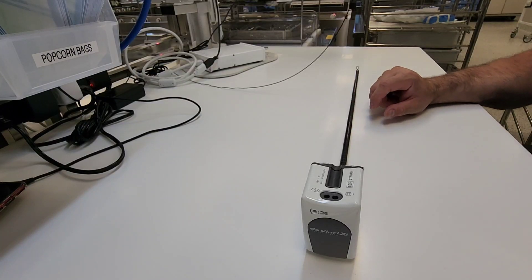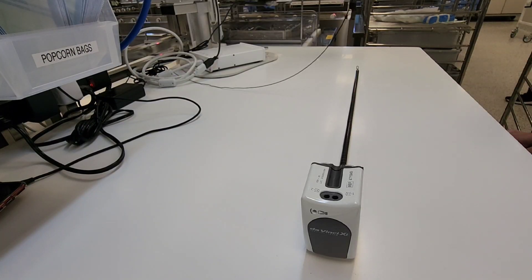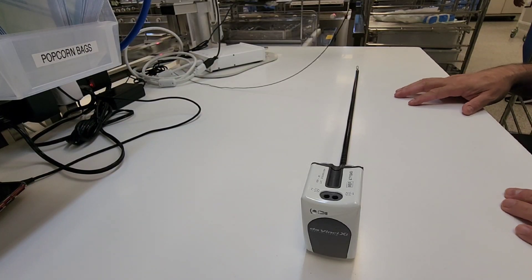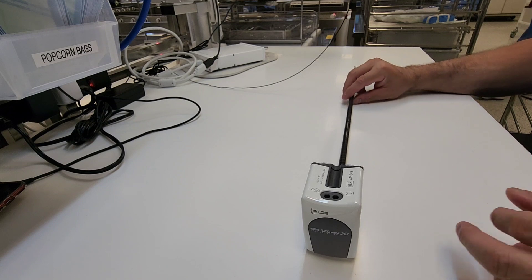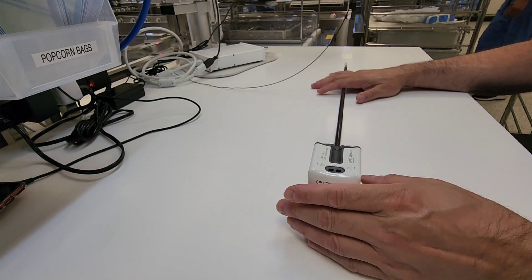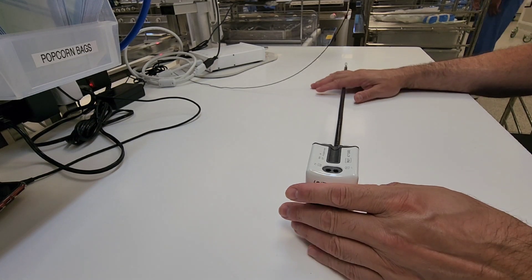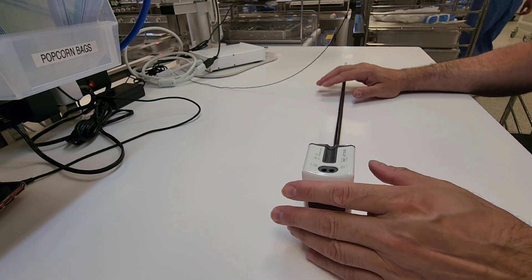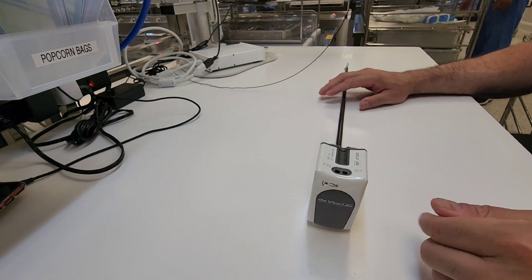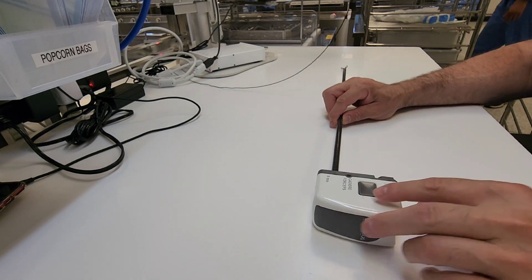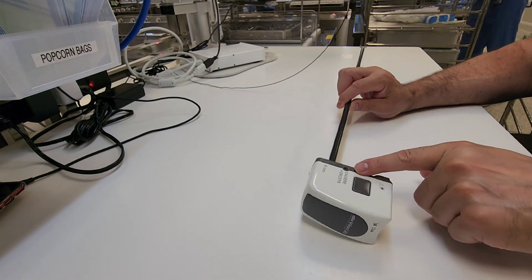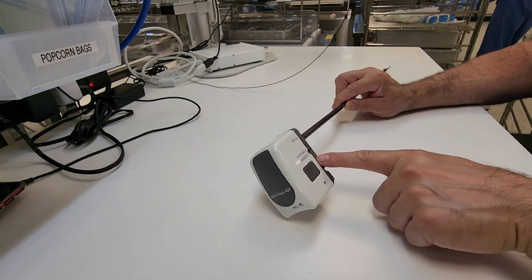All right guys, welcome back to WDYD CSP - What Do You Do as a Central Sterile Processor. We cleaned it in decon, now we're over on prep and pack and we need to go ahead and do our inspection for cleanliness and test for functionality.